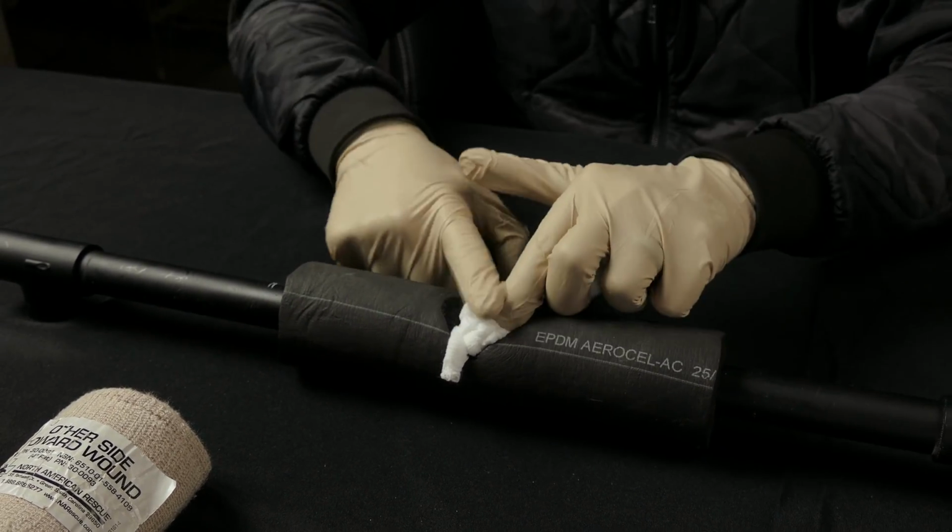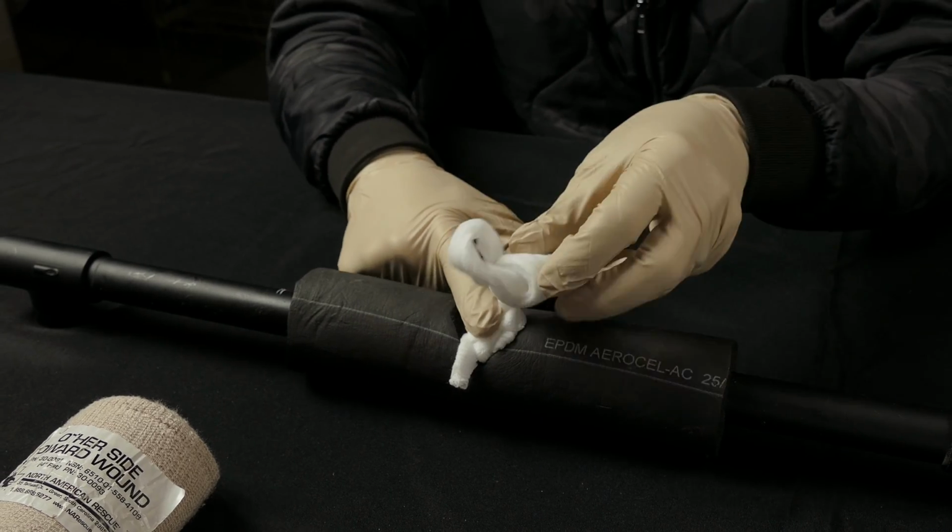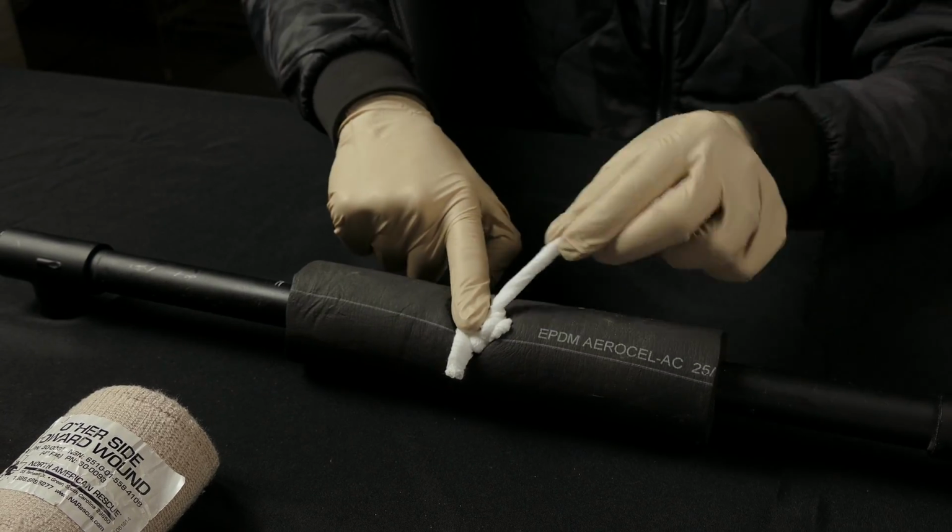Fill it up. Once this entire wound is full, I want to pack this until it comes up over the surface of the skin. Because when we put this pressure dressing on, I want it to apply more pressure to the area of the wound than just the skin. So I want that area where I'm packing to actually come up over the skin a little bit. So when we put pressure, it's putting immediate pressure right down on that area of bleeding. So pack this in here, get it there.